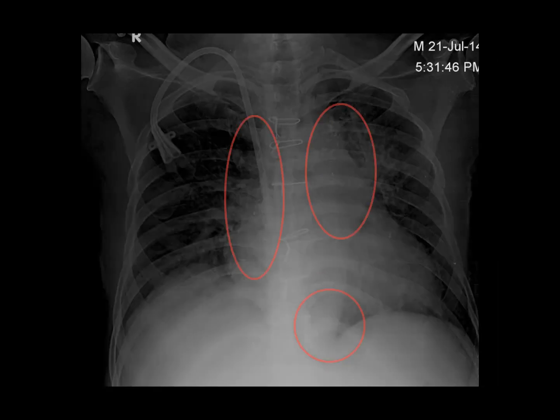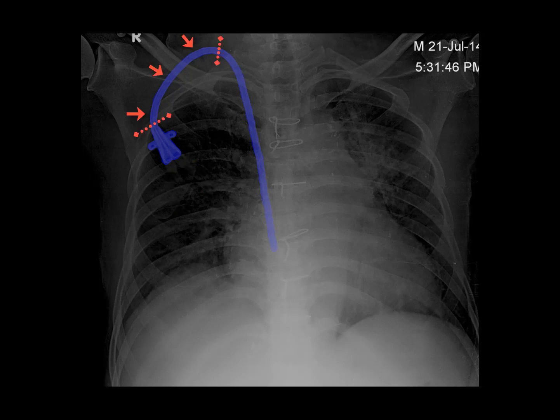Here we have another chest x-ray of a patient with sternotomy wires and evidence of prior coronary artery bypass grafting who has a tunneled dual-lumen large-bore dialysis catheter in place. You can see the two lumens here, and this portion of the tube is the subcutaneous portion, piercing the internal jugular vein approximately here with tip in the mid-right atrium, which ordinarily is fairly low for a central venous catheter, but is an ideal position for a dialysis catheter that needs a high exchange rate.